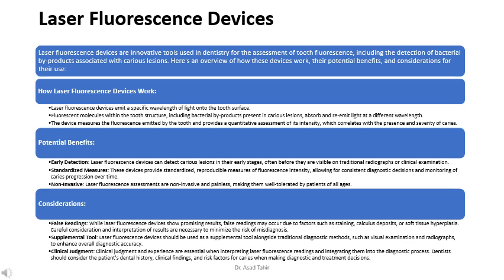The device measures the fluorescence emitted by the tooth and provides a quantitative assessment of its intensity, which correlates with the presence and severity of caries. Potential benefits. Early detection. Laser fluorescence devices can detect carious lesions in their early stages, often before they are visible on traditional radiographs or clinical examination.